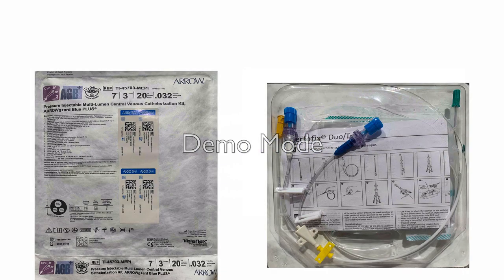Okay, and now we will go in more detail about these steps. I would prefer that you arrange your central line kit over a table, use alcohol wipes, wipe the whole table, put a sterile drape, and take the central line kit and then empty the central line kit over that table.